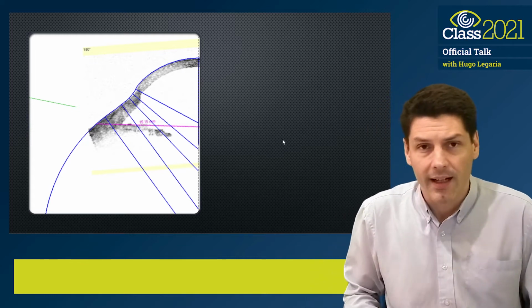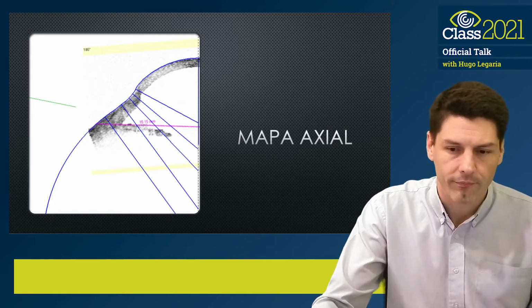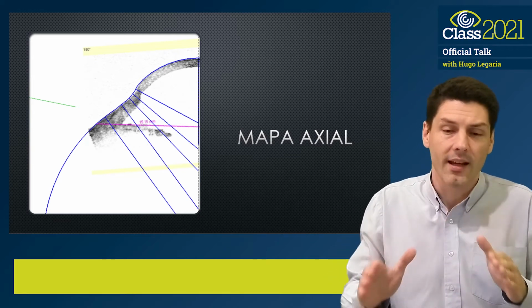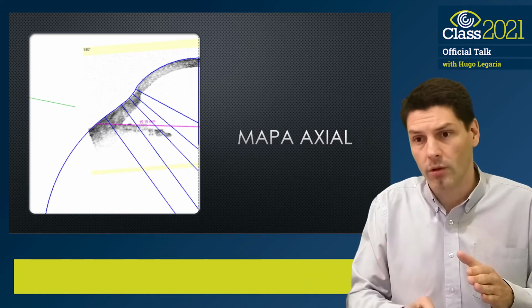The axial map and the tangential or instantaneous differ fundamentally in the mathematical conditions that are set in the software to generate the representation. In the case of the axial map, it puts as a condition that the entire surface that is generated must have a rotation axis in the center of the visual axis.